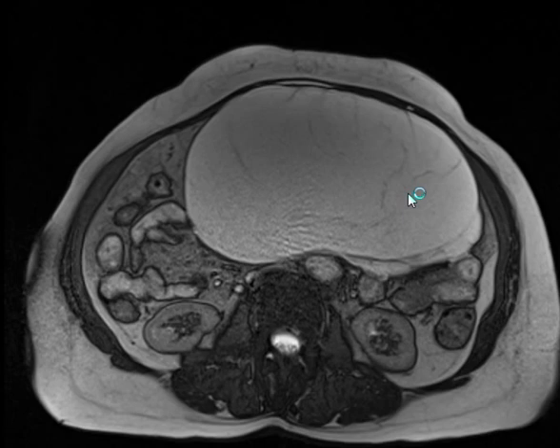Hydatid. What's against hydatid? What's with hydatid? Why did you say hydatid? So why is it hydatid? As we said, it's common in our region. It's common. First, second.